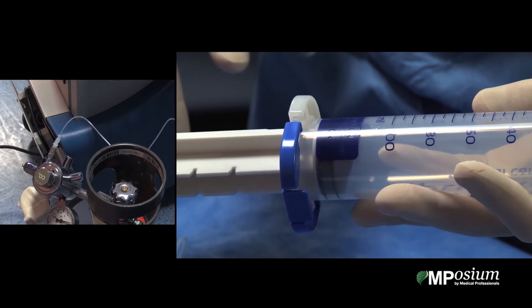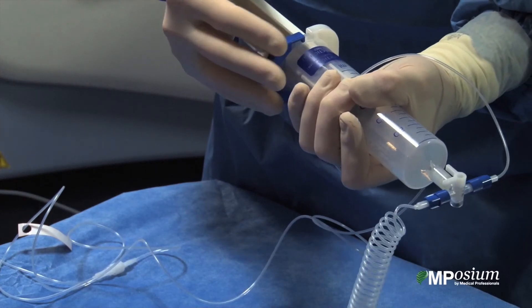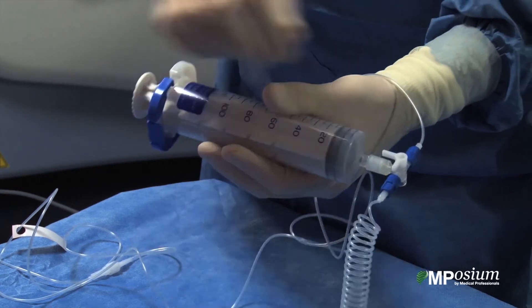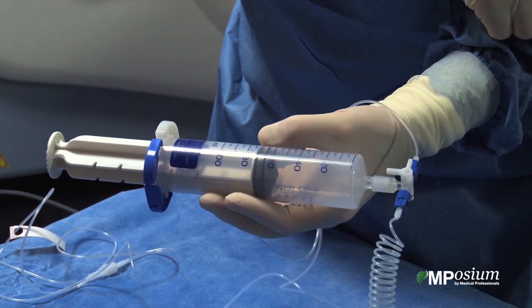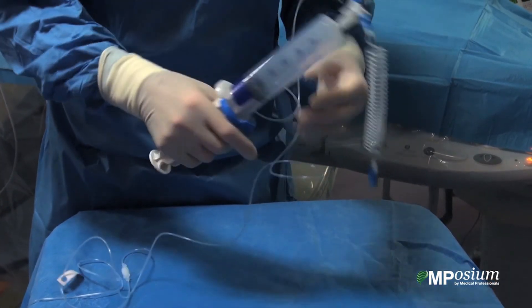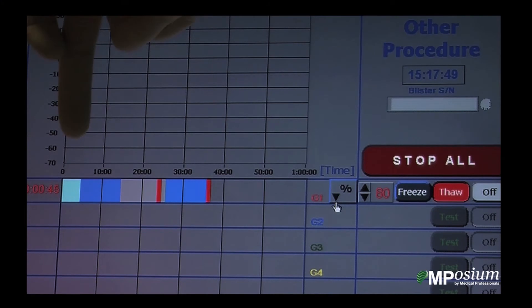The nice thing about this syringe is that there is a stop and it cannot go away. So when we are in the patient, we will inject the carbon dioxide this way and we will load the syringe again this way.